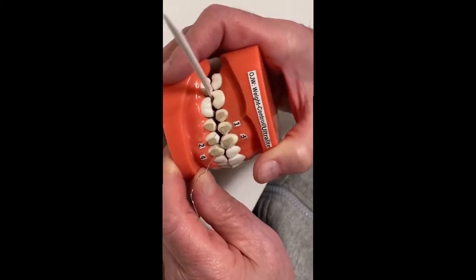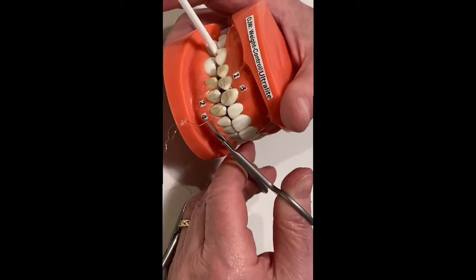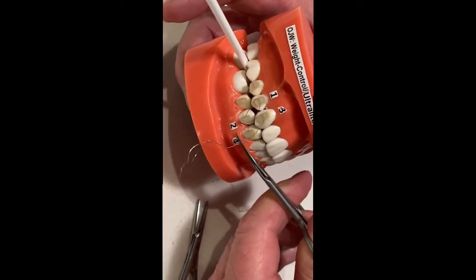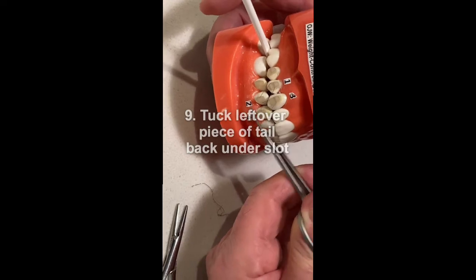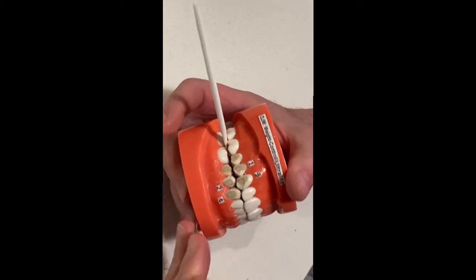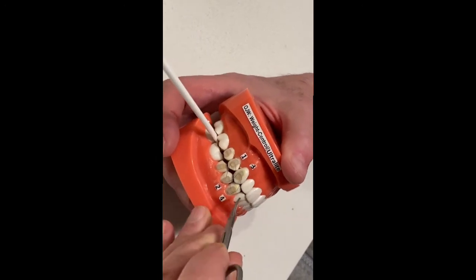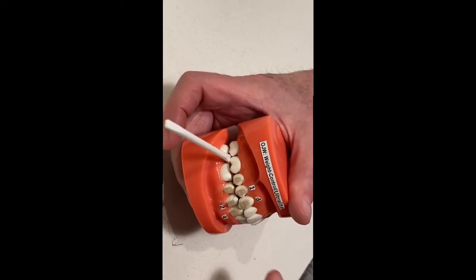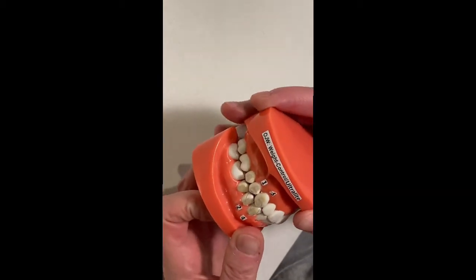And then you take a scissor, you leave a little bit of tail, cut it off, and then tuck the little piece that's left over back under the slot and out of the way so that it doesn't stick you or bother you. Then you remove the stick from between your teeth, and there you are in OJW weight control Ultralite.